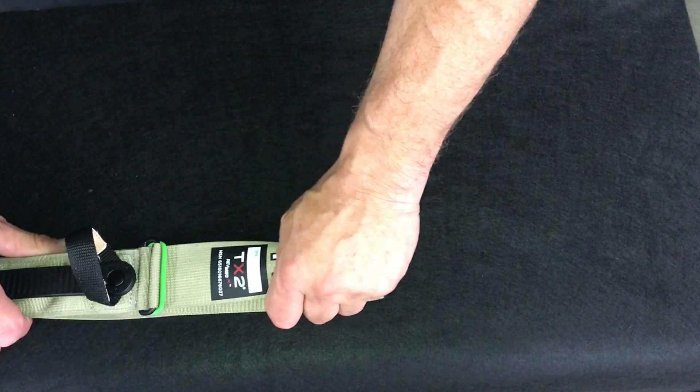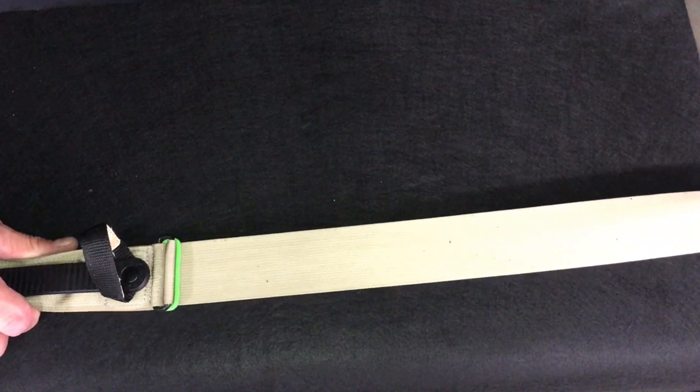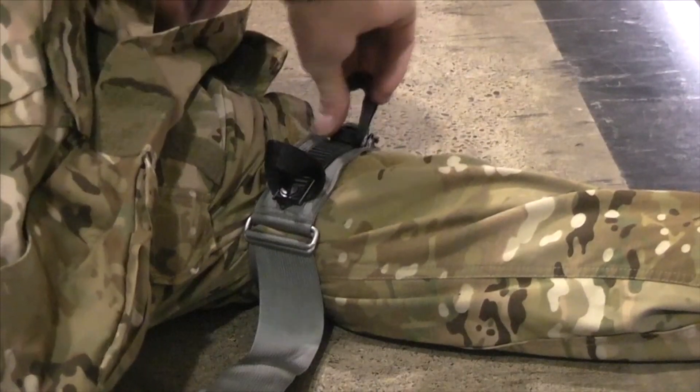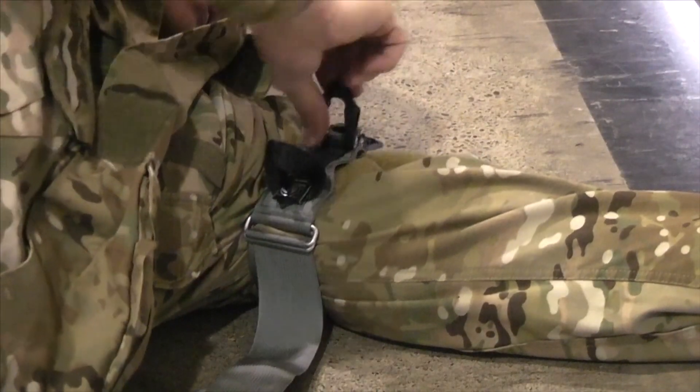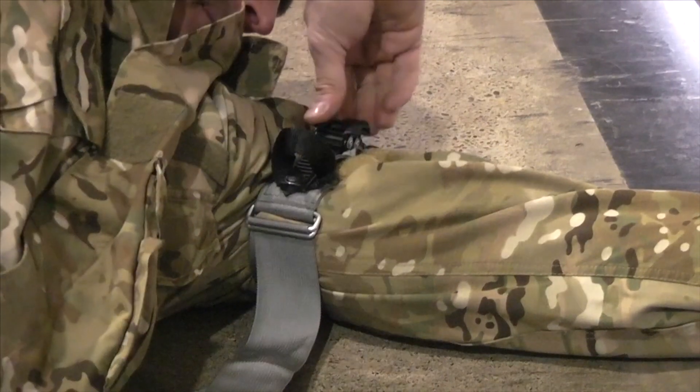The TX2 is designed for straight-line pull, which does not stress the nylon. This allows you to train with the same tourniquet you are carrying. Frequent training with your tourniquet establishes muscle memory, making tourniquet application second nature.